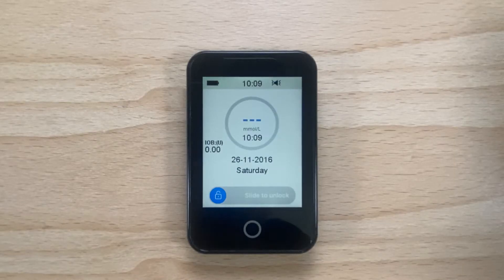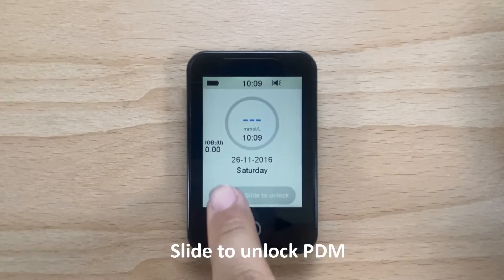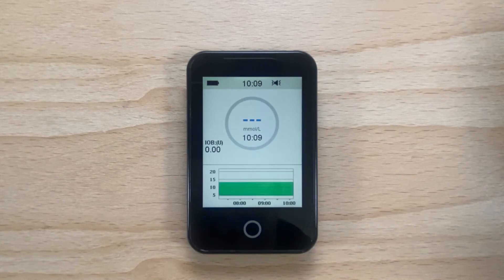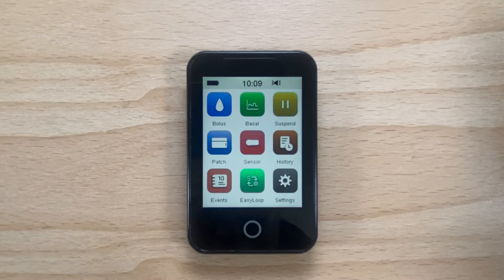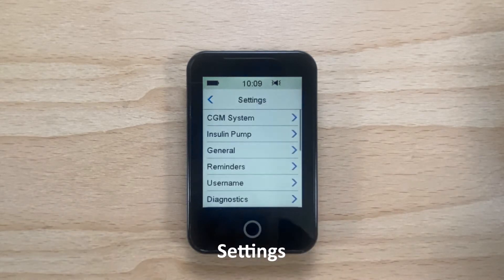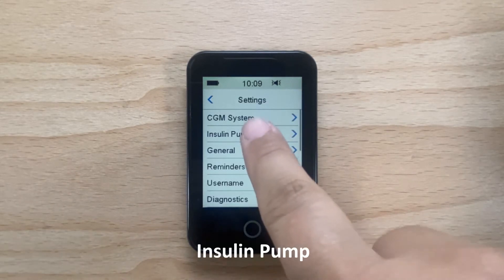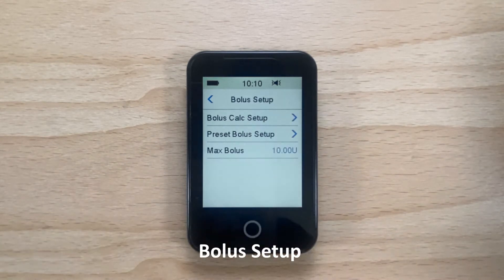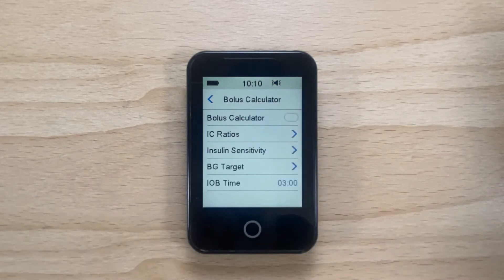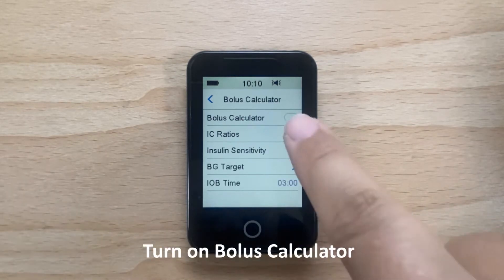To set up the bolus calculator on your PDM, slide to unlock your PDM, then slide your finger from right to left to access the main menu. Tap on Settings, tap on Insulin Pump, tap on Bolus Setup, tap on Bolus Calc Setup, and ensure the bolus calculator is turned on.